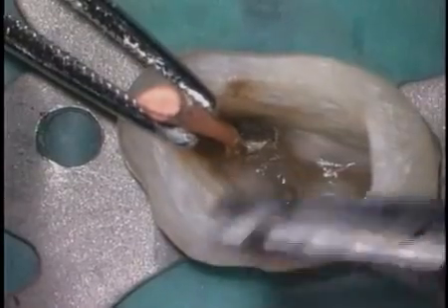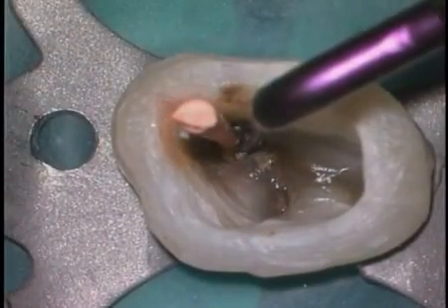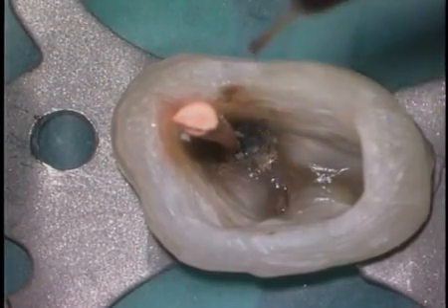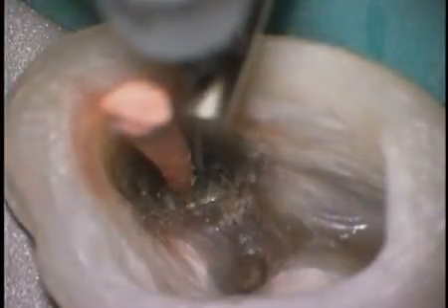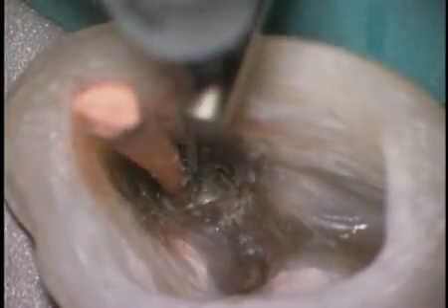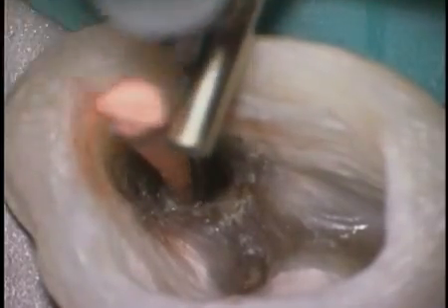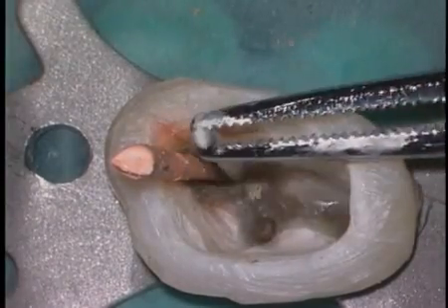The paper points blot up surplus moisture, and direct ultrasonics can be utilized to move the material into the desired position. If in fact direct ultrasonics is too vigorous, we can stick a 15 file into the MTA, and in an indirect method, we can vibrate on the shaft of the file, which will make the material slump and float it very precisely into place.